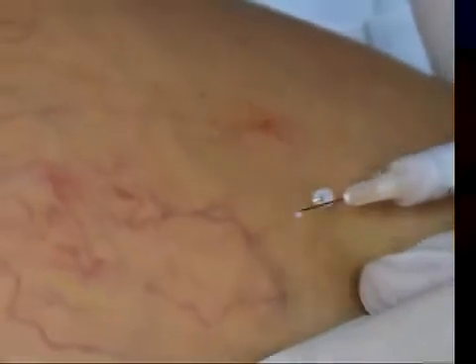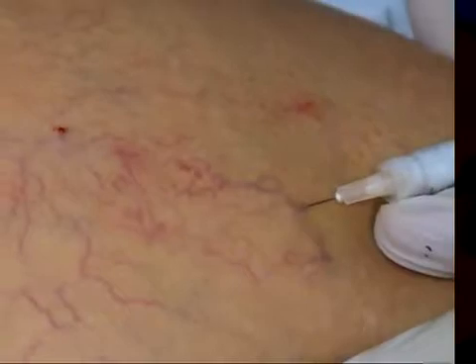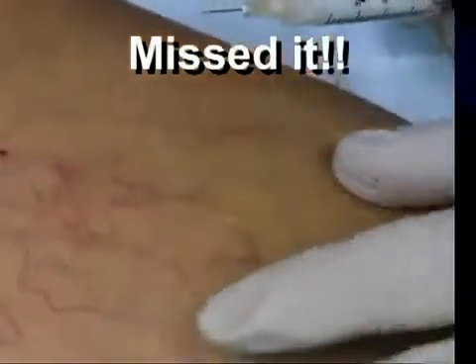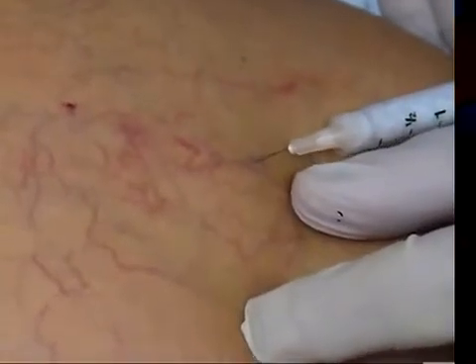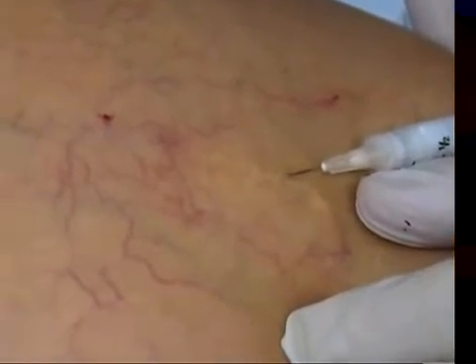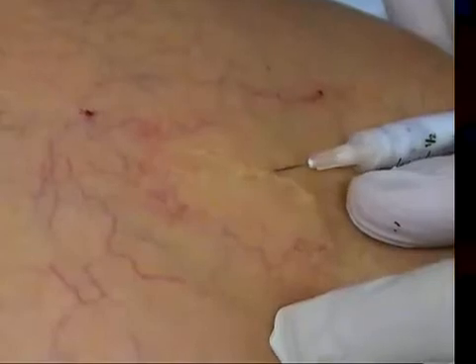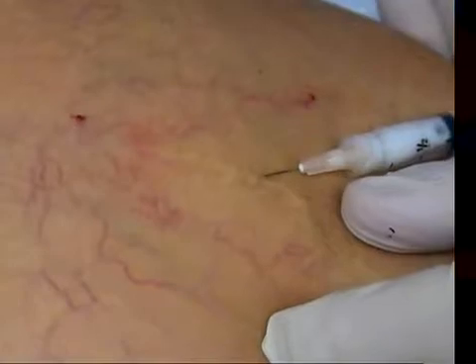Let's go in here — nice deep one. Now there I'm a bit worried about extravasation, so I'm going to come out. That looks good. Now this stays foam for about a minute or two, and after that you find the foam is lost in the syringe, so you want to come out then and foam it up again.